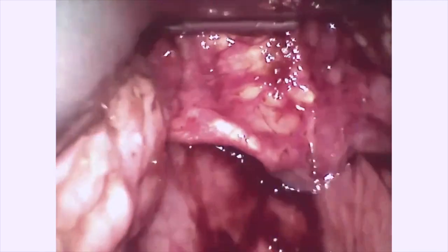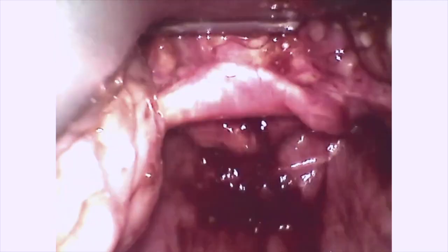One of the challenges here, we can pause there, is that we have that tongue and all that lateral soft tissue that's really folding underneath, right? And so I think you hear a lot of debate about going down the middle versus sweeping the tongue. This is one where losing control of the tongue is obscuring some of our view and would definitely affect our passage of a tube. Let's go ahead.